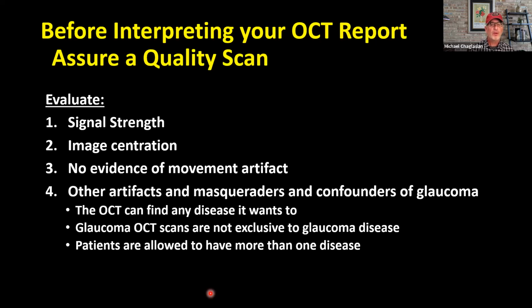So we're going to spend a whole section on that later on in this evening's presentation to talk about some of the artifacts and, more importantly, the masqueraders and confounders of non-glaucomatous conditions that can really fool us and trick us into thinking that our patient might have glaucoma when really it's some other form of retinal disease or optic neuropathy.